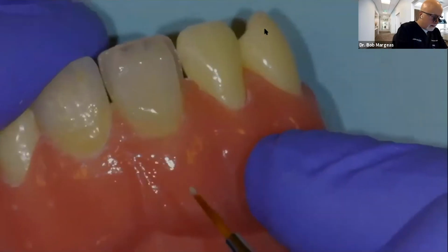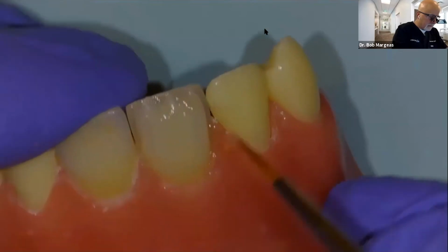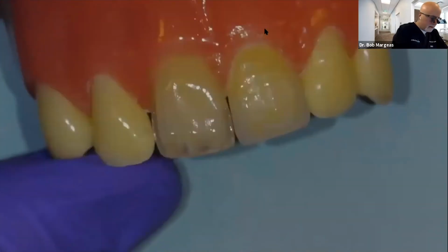A little bit there. So you can kind of see what we're talking about.